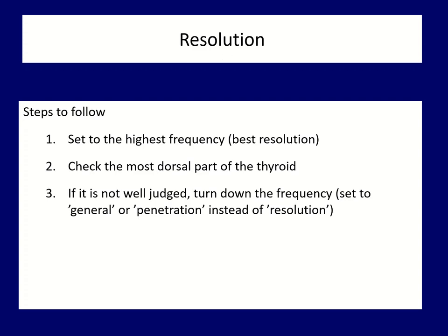The easiest and fastest way to set depth, focus, and adequate frequency is after a quick scan of both lobes searching and checking the most dorsal part of the thyroid. Wrong adjustment can either lead to incorrect nodule diagnosis or cause us to overlook slightly less echogenic nodules.